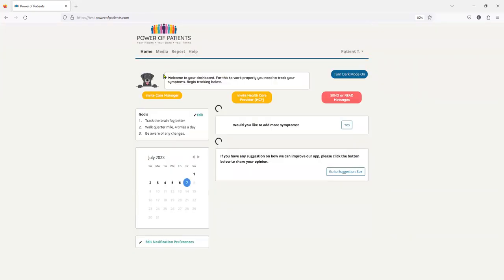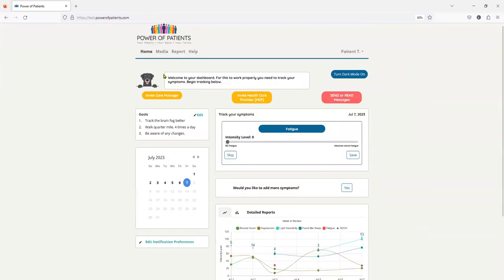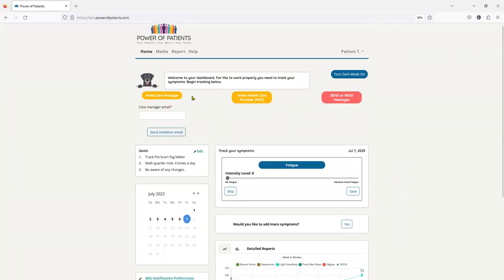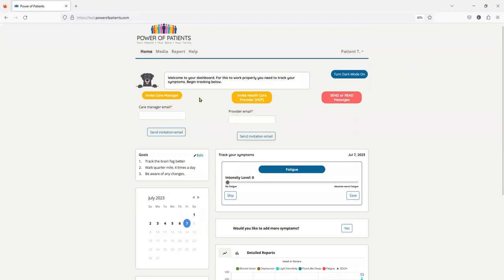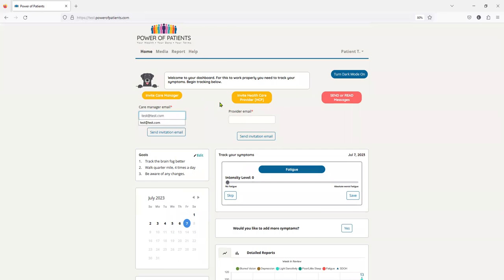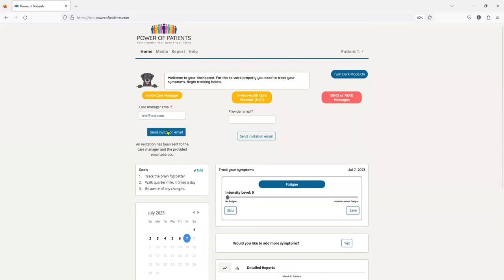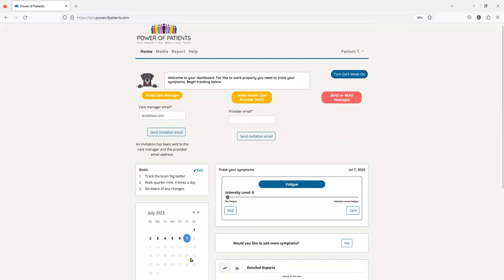And then the only other thing to show you from location perspective is if, now you can see it's all red, if I wanted to invite a care manager or if I wanted to invite a healthcare provider, you would just simply type in their name, and I'll just put it in test at test.com. It's just a fake email. And you hit send, and that's it. I'm going to log out, and then I'm going to log back in as a care manager and then a provider, so you can see all those views.